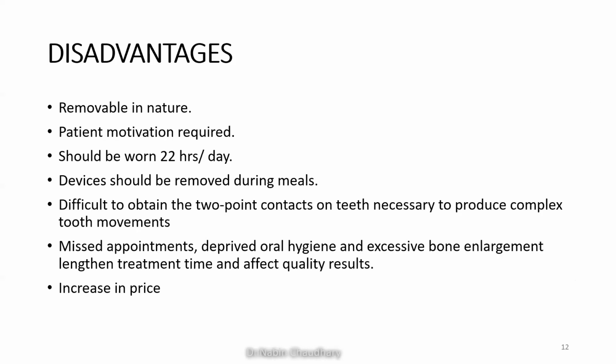Whereas the disadvantages include it is removable in nature, and since it is removable, the patient motivation is required, and it should be worn for a minimum of 22 hours per day, and it should be removed during the meals. And also, the two-point contact is difficult to maintain on the teeth to produce the complex tooth movement. And also, the missed appointments and the deprived oral hygiene and the excessive bone enlargement can lengthen the treatment time and affect the quality of results. And also, the cost of the clear aligners is high.